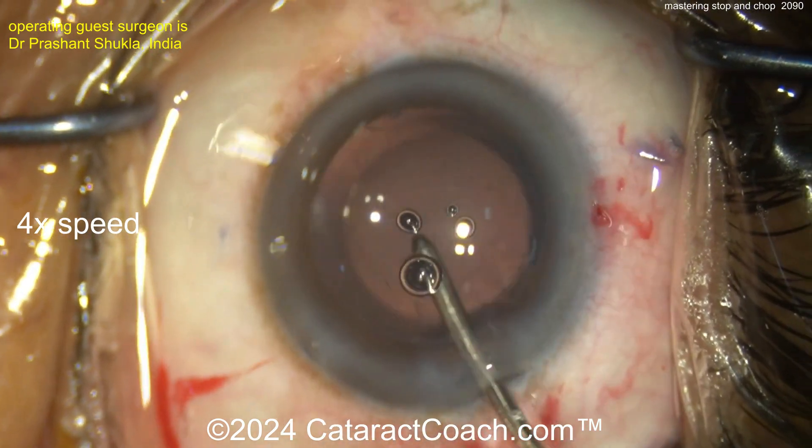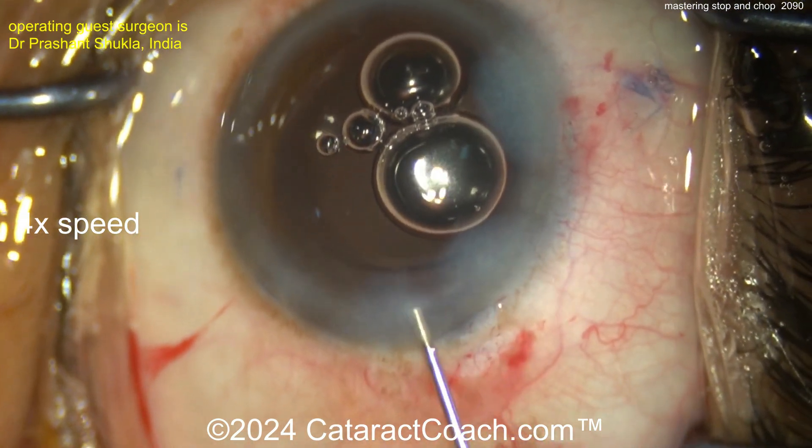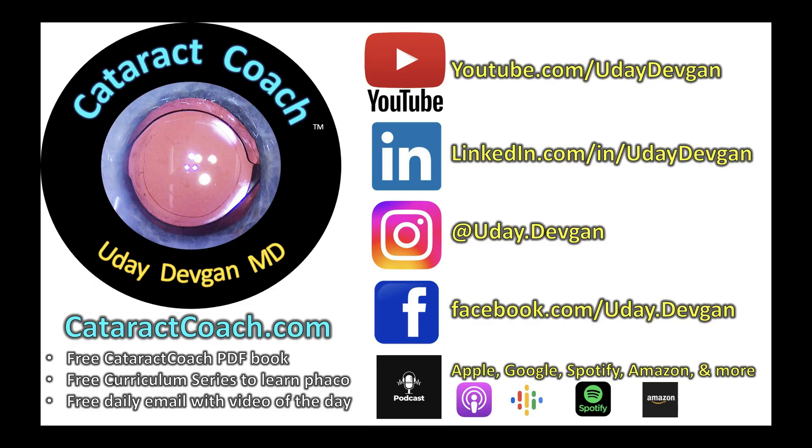I like that hydra-implantation that was done, so no need for more viscoelastic. That looks fantastic. Sealing up the incisions and we're done. Beautiful job with Stop and Chop.